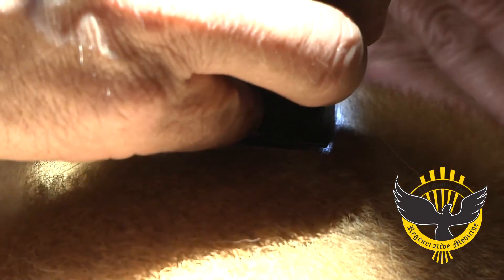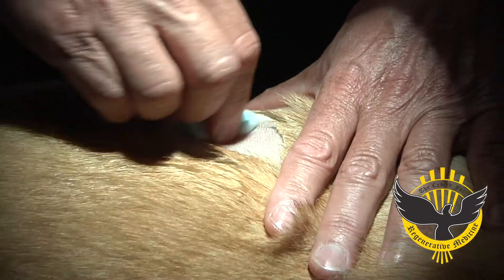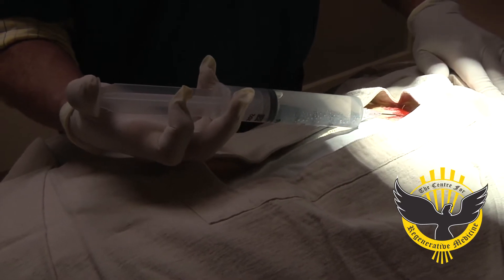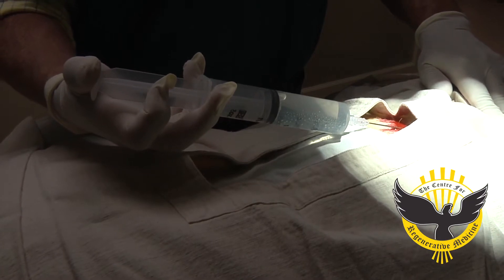We utilize aseptic technique to collect the cells since we do not want any possibility of contamination of the sample. We make a stab incision in the lateral thorax, insert our specialized cannula subcutaneously to infiltrate the cells with our collection solution.